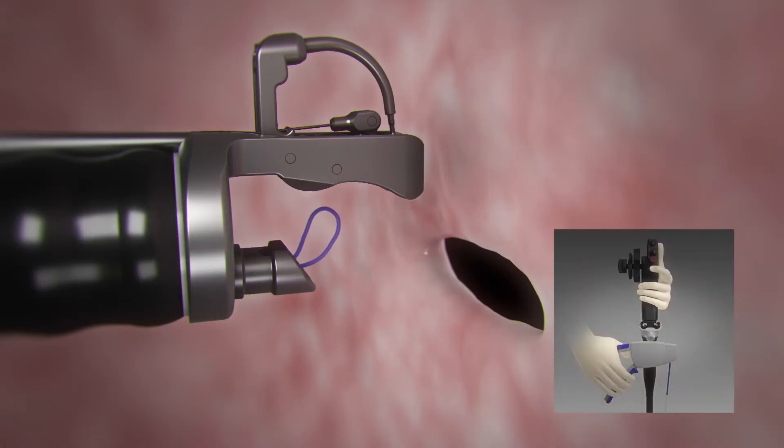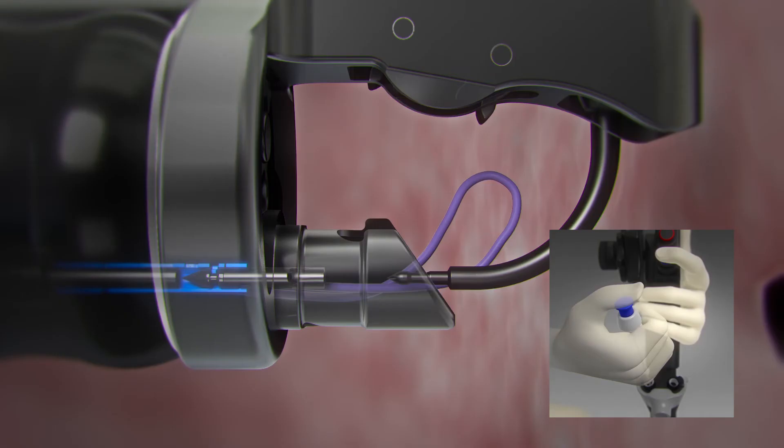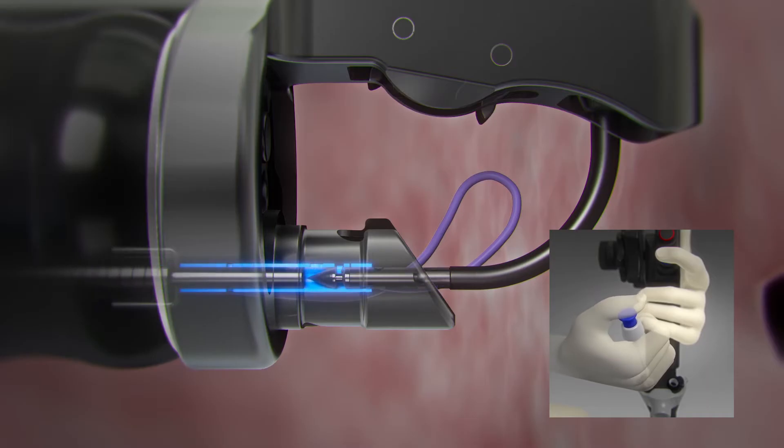Prepare to load the needle body by closing the needle driver handle. Advance the anchor exchange catheter until the anchor clicks onto the needle body and will not advance further.